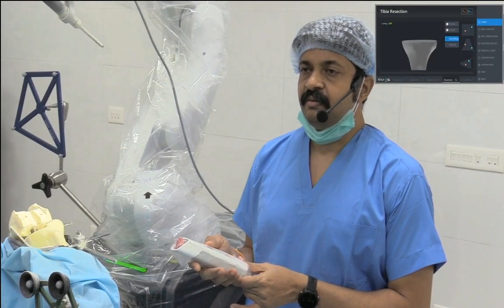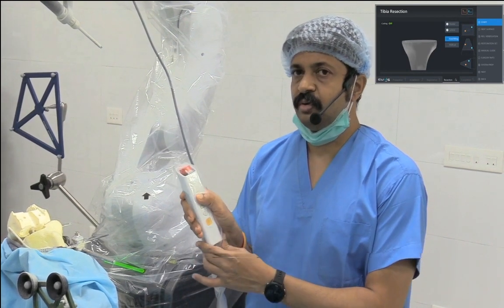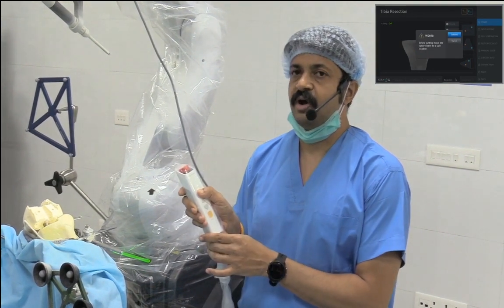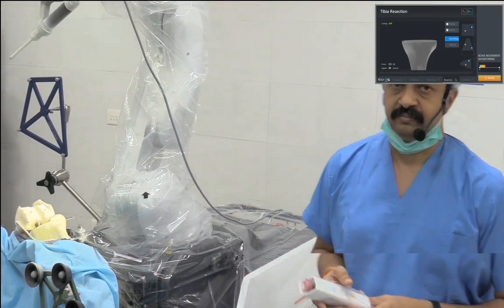So as you can see, we are ready to do the keel wing, and at the press of a switch on the remote, I just say start. This is it. It asks me to confirm again. Moment I confirm, the cutting action will start. The robot is back in action.